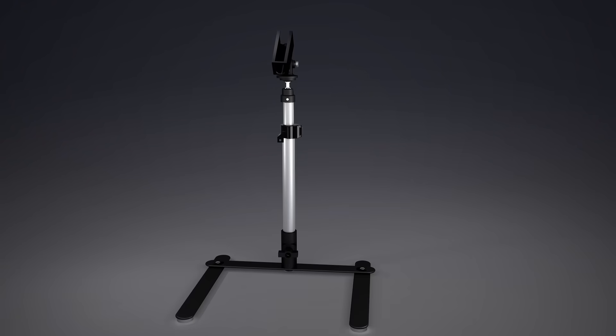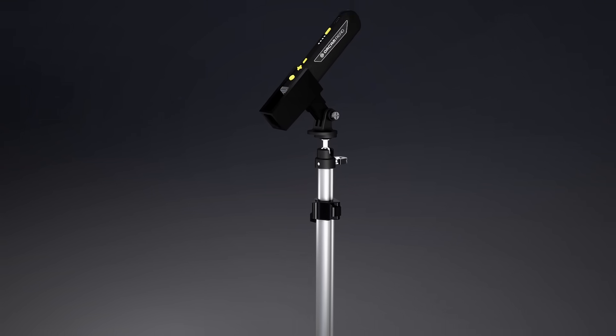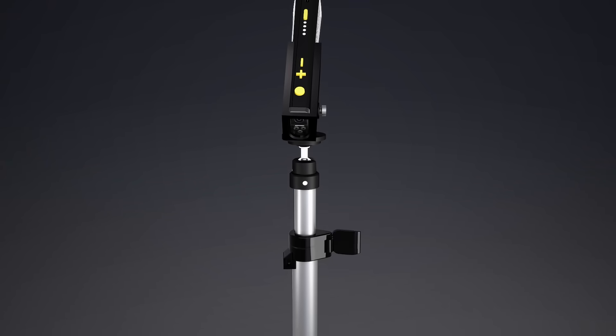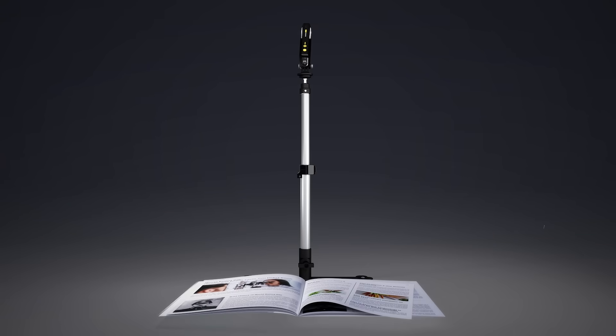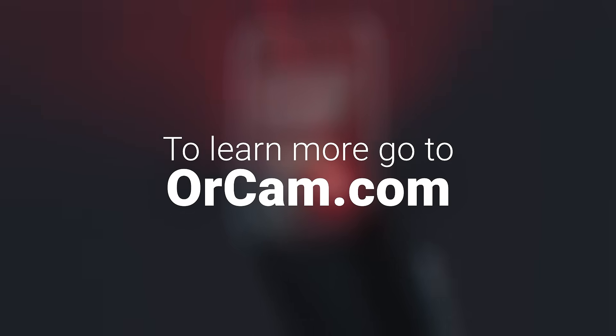Or you can use OrCam Read 3 in a fixed position with our dedicated stand. And for added convenience, you can use voice commands and hand gestures to operate the device while it's stationary on the stand. This product has been expertly crafted to cater to your evolving needs. Keep scrolling to unlock the full potential of the OrCam Read 3.